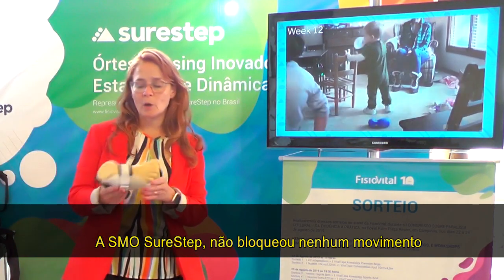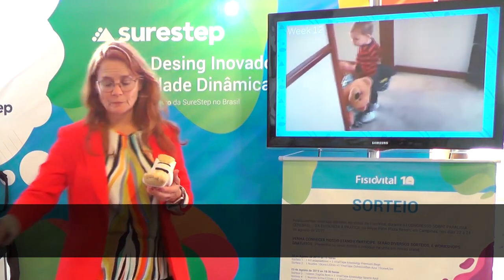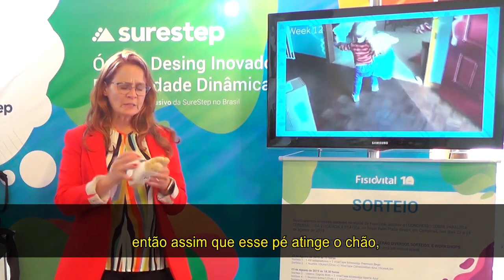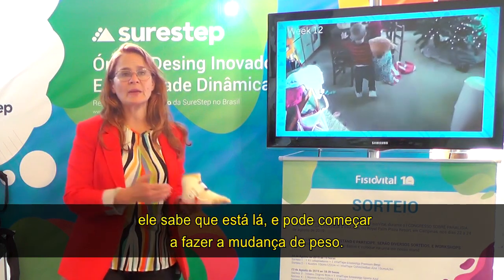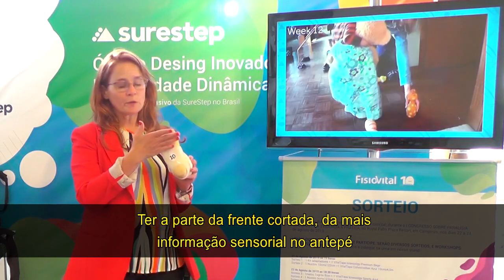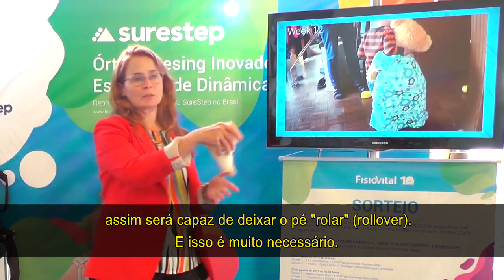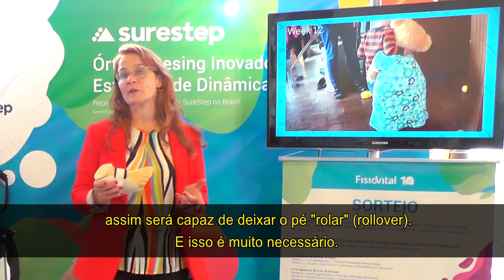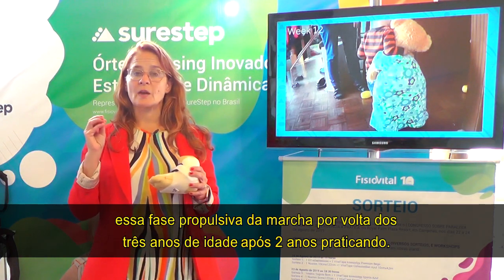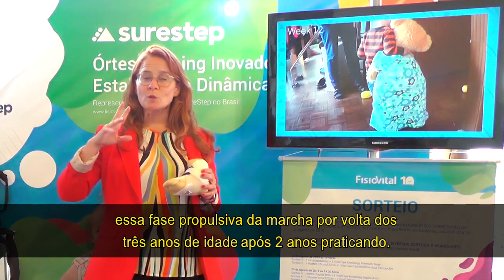The SureStep SMO hasn't taken away any movements that are necessary to develop postural control or balance. By having an open heel cut out, we're getting sensory input to the heel so that as soon as that foot hits the ground, he knows it's there and can begin to shift his weight. The short foot plate also gives sensory input through the forefoot, and it's designed not to interfere with propulsion in terminal stance — we're able to get that rollover happening through the foot. Typical children begin to develop that propulsive phase of gait around age three, after two years of practice.